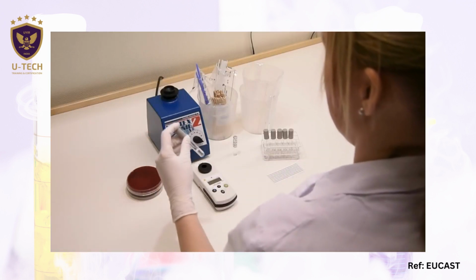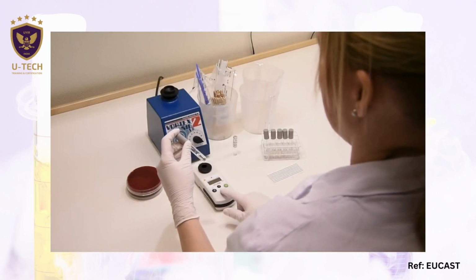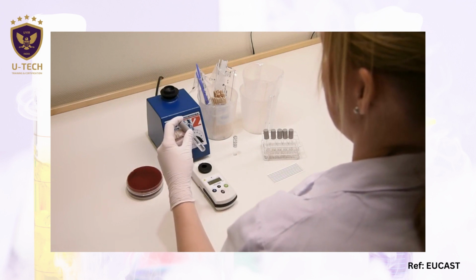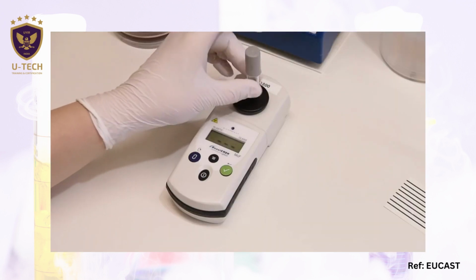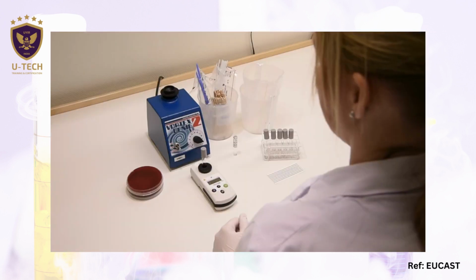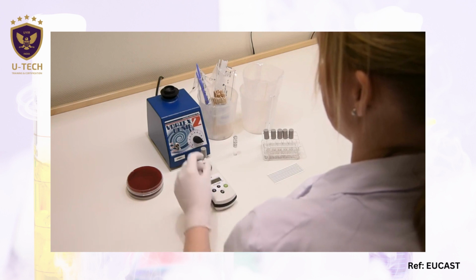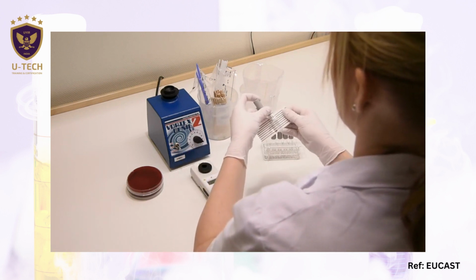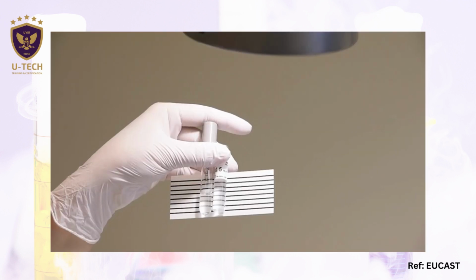The density of the inoculum suspension should be equal to 0.5 McFarland standard. It is recommended that a photometric device is used to measure the density of the suspension. Alternatively, the density can be compared visually to a 0.5 McFarland turbidity standard.